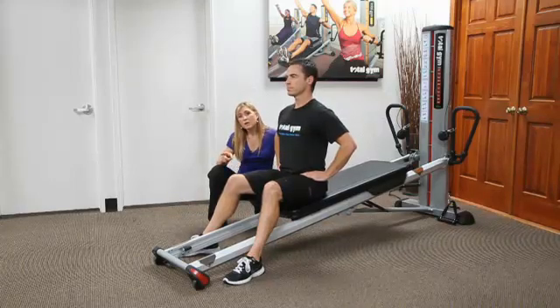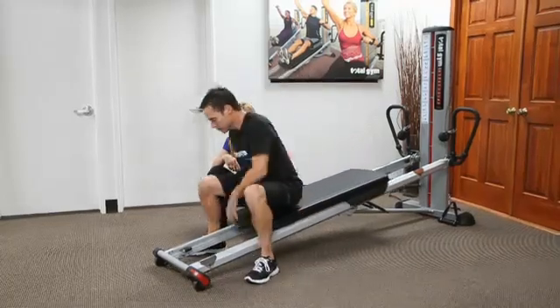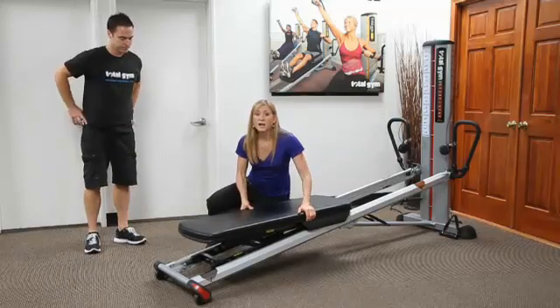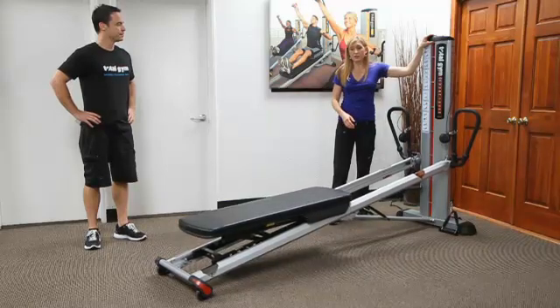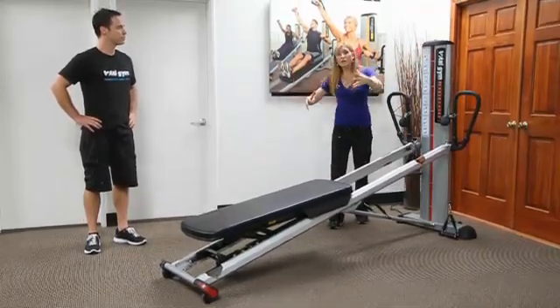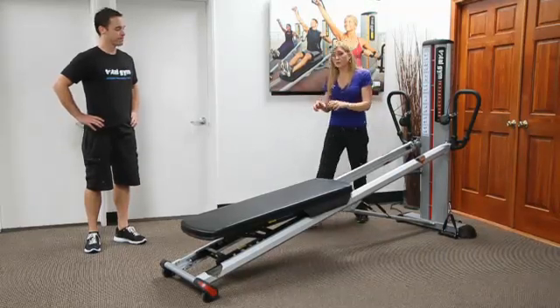So the last thing I want to go over is the fact that I'm going to have you slowly stand up. I'll stabilize the board for you. Is that the board, again, comes up. And I love, love, love this feature. Because oftentimes we are working with planks and for shoulder stabilization. And we go from like a plinth to maybe a bench to a floor. And it's kind of hard to document when they're building their progression in strength.